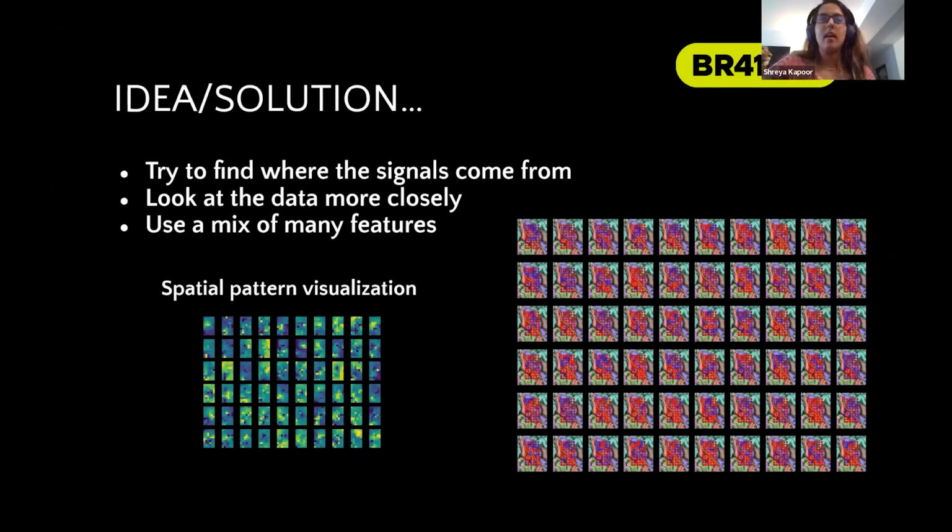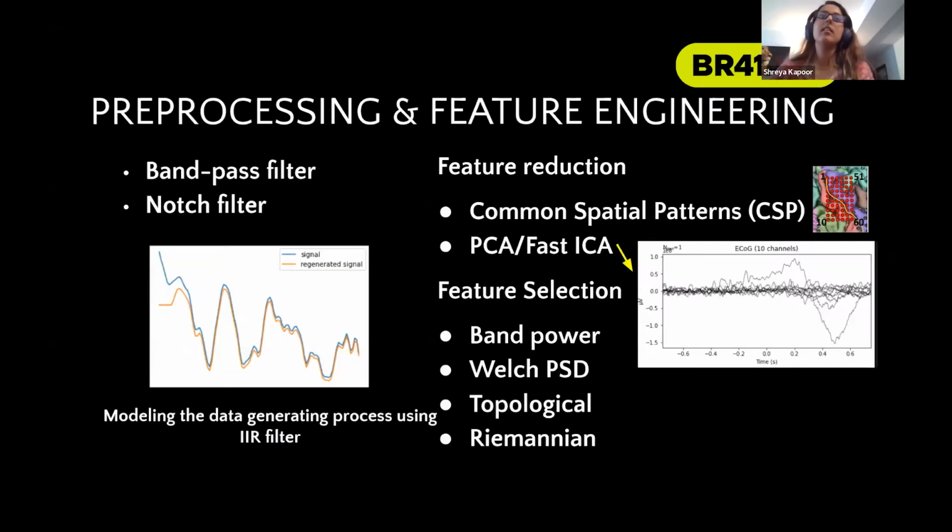On the next slide, you can see we first wanted to understand how to go about preprocessing the data. We took inspiration from the paper, which mentioned a bandpass filter and a notch filter. So we used this, and we tried different types of parameters, and the configurations that we found working well with the classification algorithms will be presented in the results section.